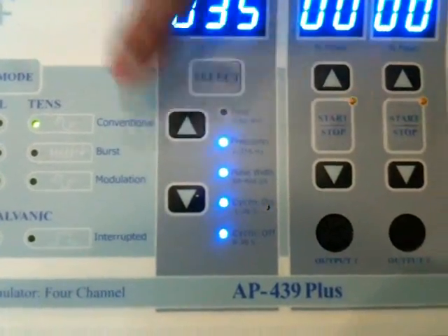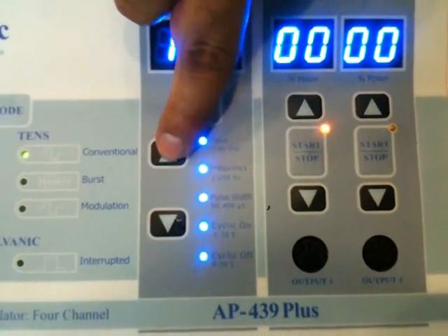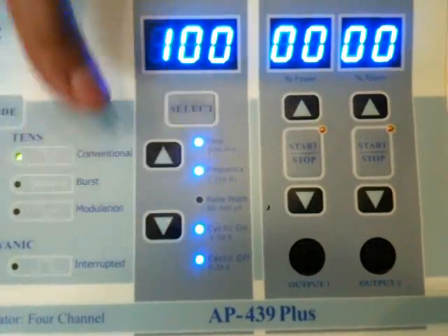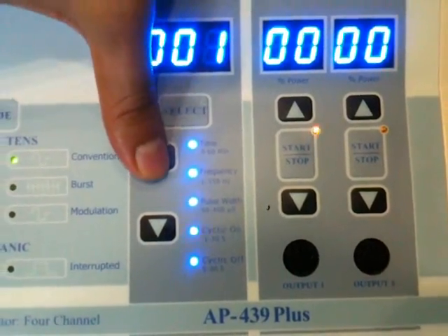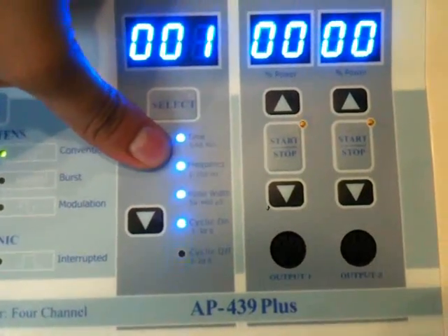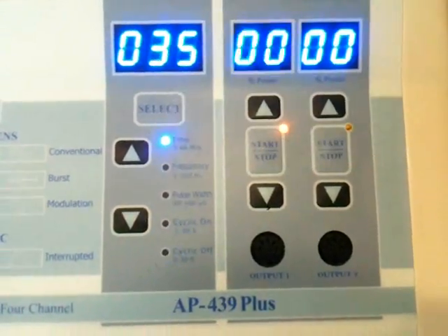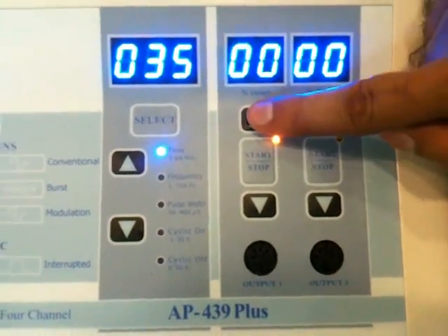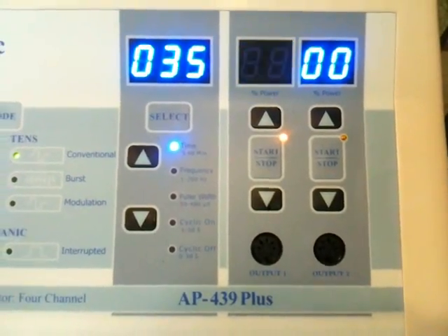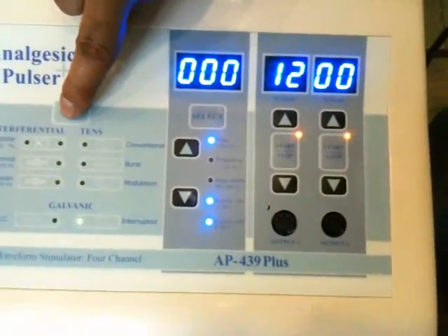Here are the settings: timer, frequency, pulse width, cyclic on, cyclic off. Now saving the treatment parameters — pressing the key again. It's activating, blinking the window, it's activated. And now rising the intensity. This is TENS.